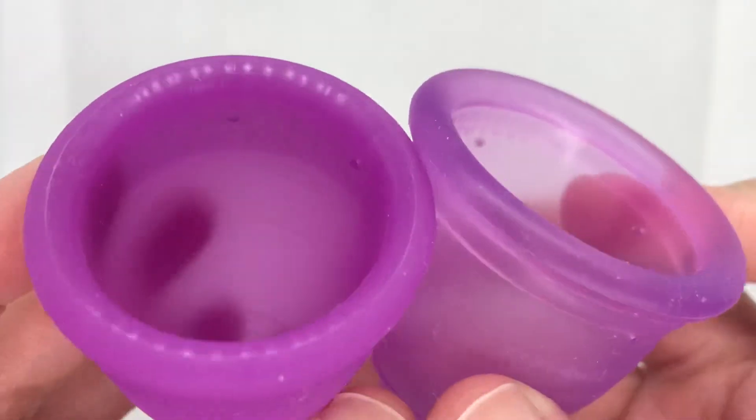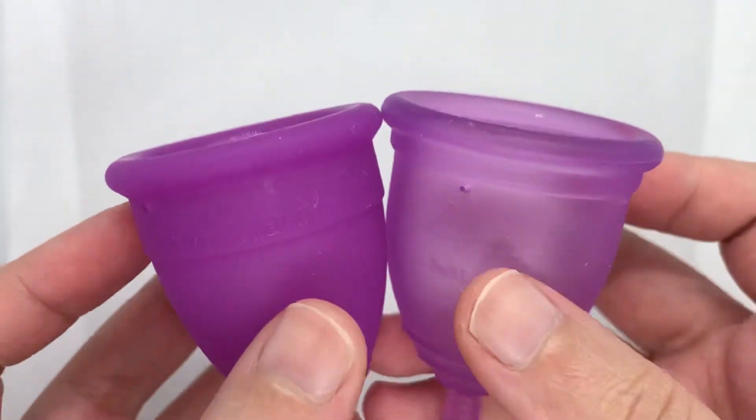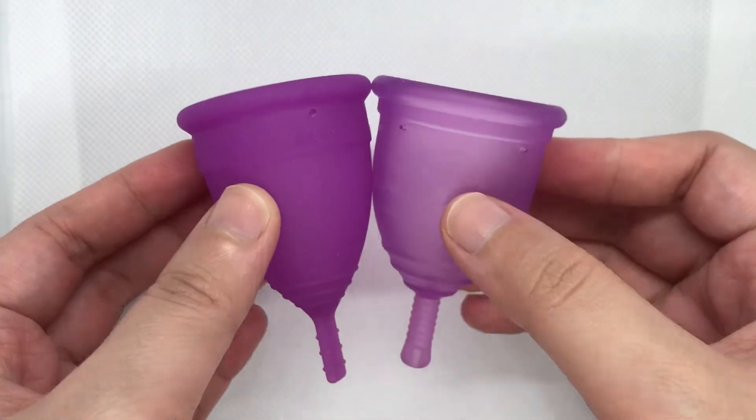There goes the Ruby Cup in size medium and the Lunette in Model 2.